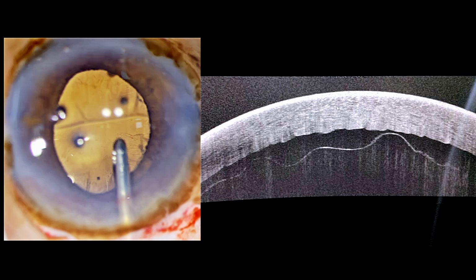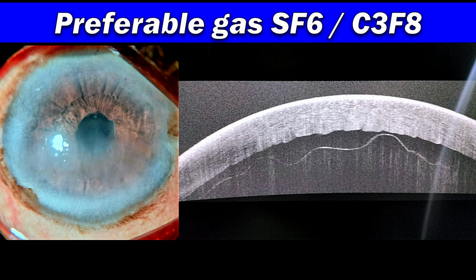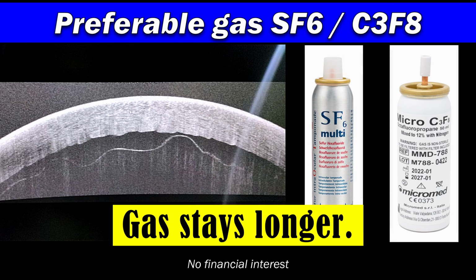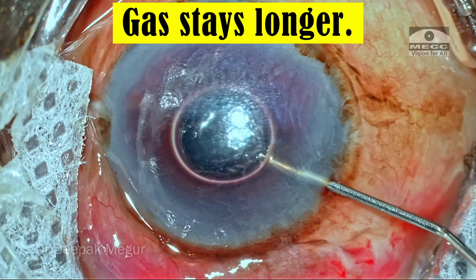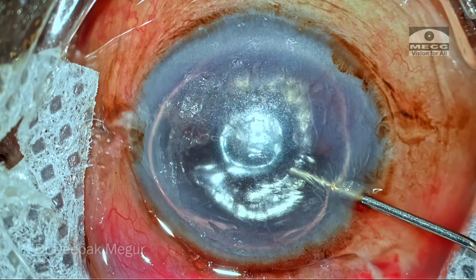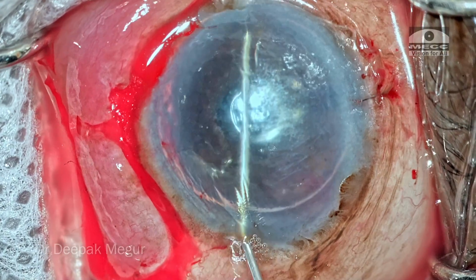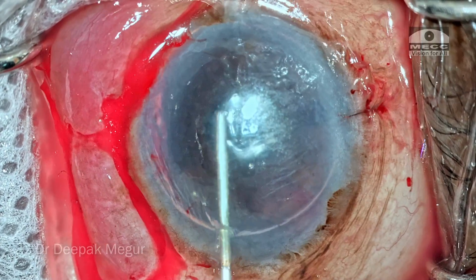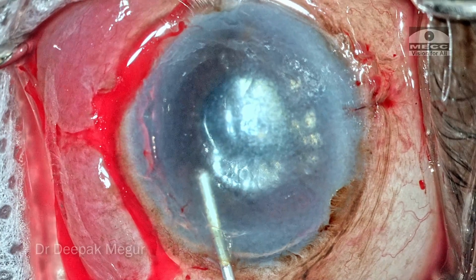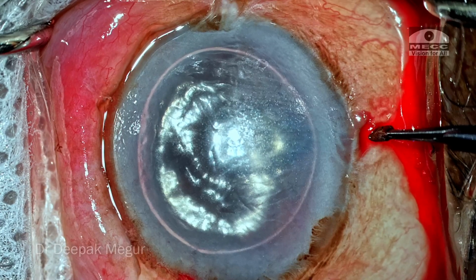And so we have a task at hand. So let's see how it has to be managed. I prefer to use gas tamponade for inferior detachment simply because the gas stays longer and provides adequate tamponade for the inferior quadrant, which is quite tough to manage. When you're trying to do an overfill, especially with SF6 or C3F8 gas, it is handy to have a peripheral iridectomy in place to prevent pupillary block, which is a realistic possibility.